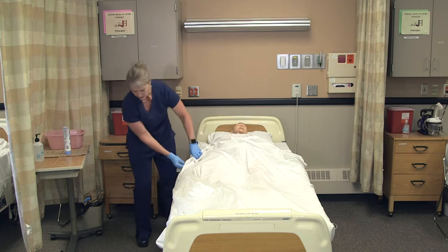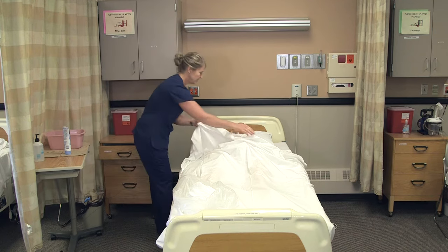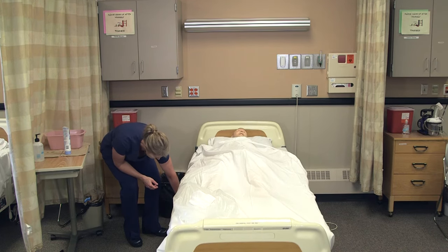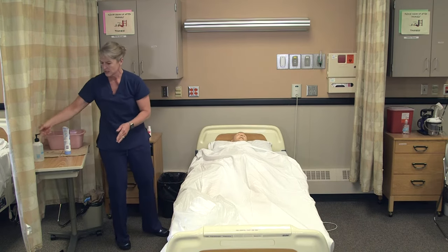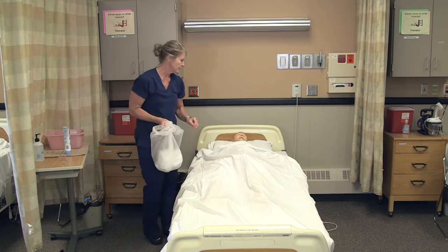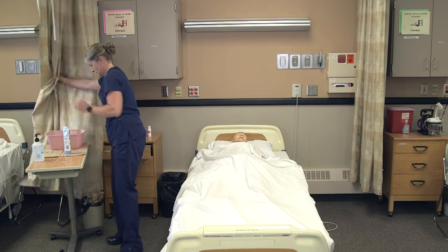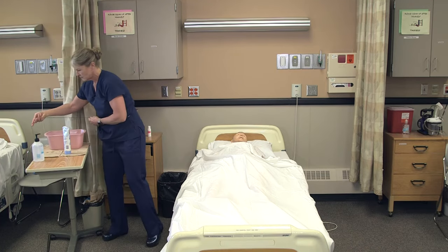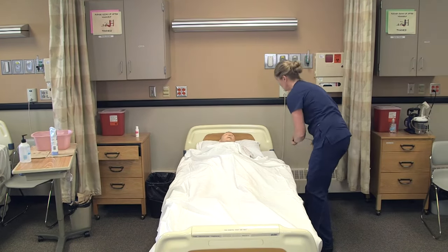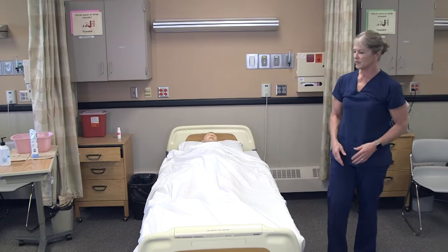I'll make sure it's draining correctly and everything looks fine. I'll remove my gloves: 'Are you comfortable, Lee?' I'm going to lower the bed, wash my hands, make sure the bed is locked, take my dirty linens and bring those to the dirty supply, make sure he has his call light, open the curtain, and get his call light in place. Of course, report any skin concerns to the nurse.